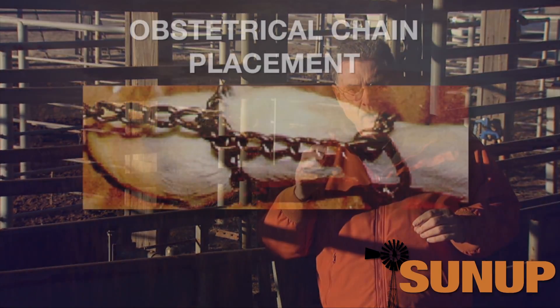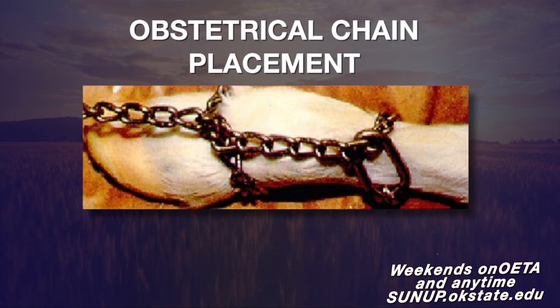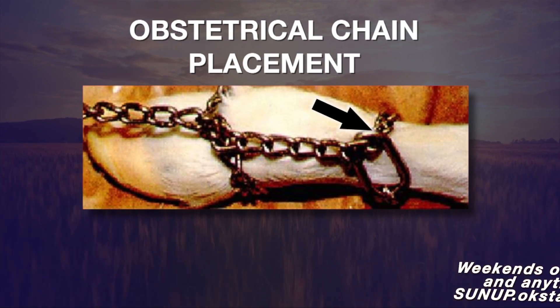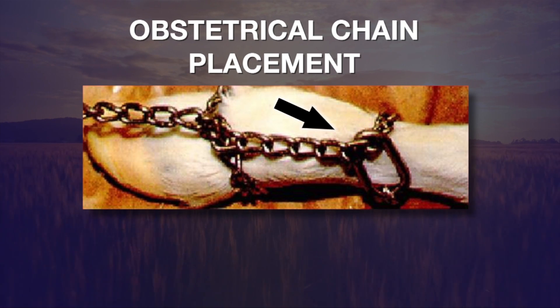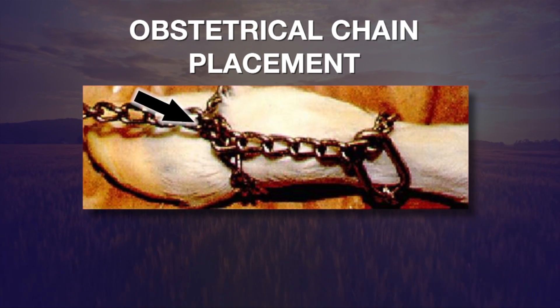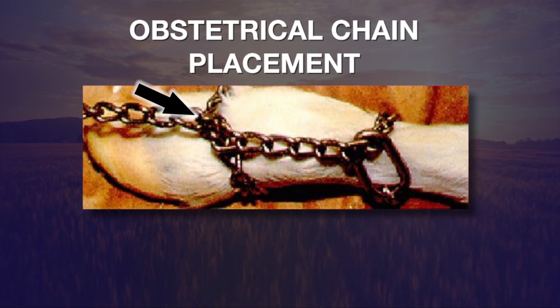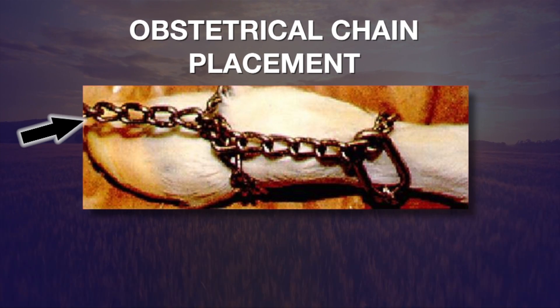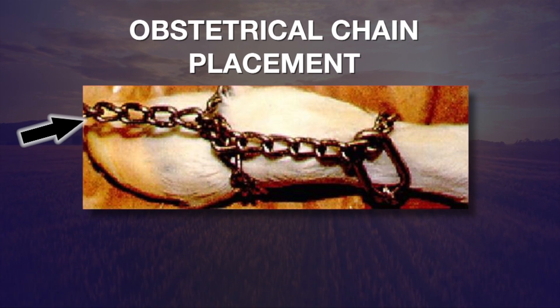Start by putting a loop of the chain right above the ankle or the fetlock. Then bring the chain over the top so we can have a half hitch right above the baby calf's hooves. As we finish that half hitch, make sure that the chain is coming out over the top of the toes rather than underneath.